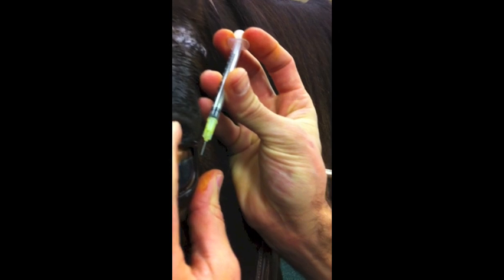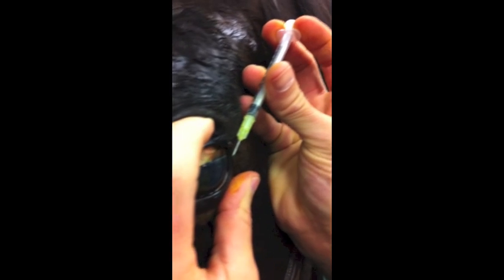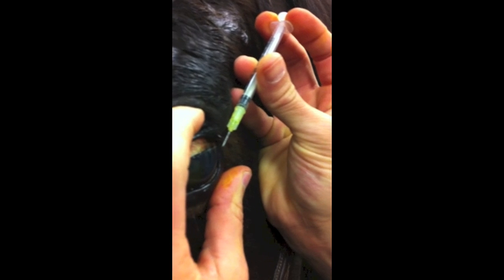Slightly tilt. Can you see? Do you have a good angle? Kind of, yeah. I think that's okay.